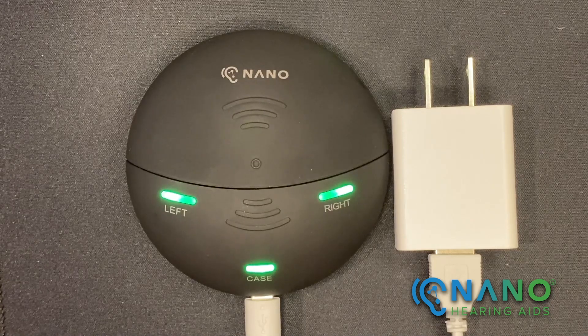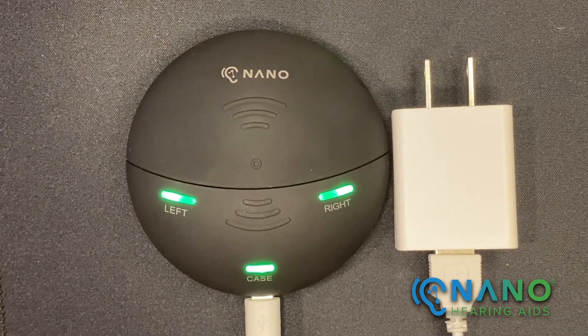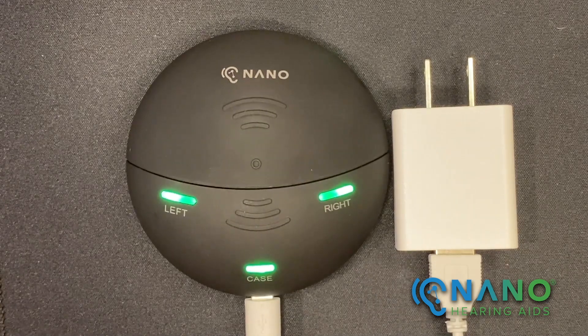You'll find that the charging case has a top and a bottom. The top can be lifted off the case. Both the top and the bottom have ridges that will help you grip each piece, making it easier to separate the two pieces.